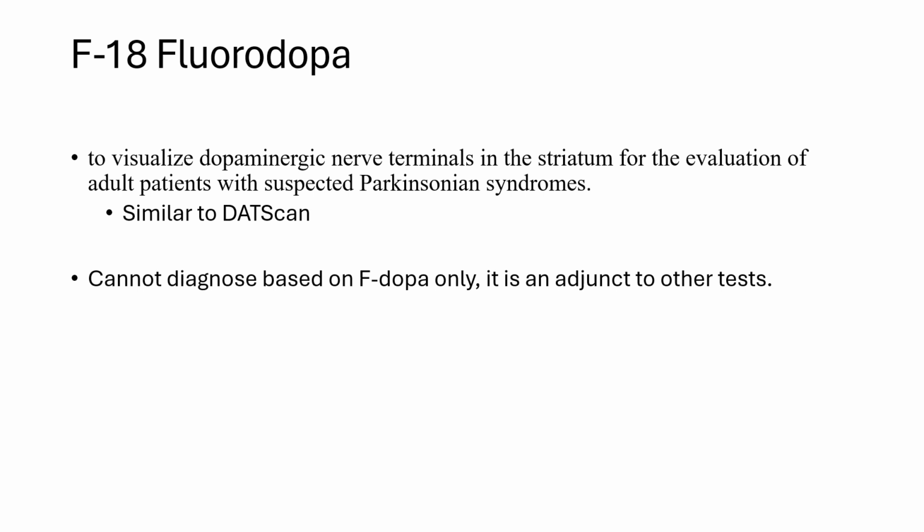We cannot diagnose based on F-DOPA only, so it's very similar to DAT scan in that as well. Both of them are used as an adjunct to other tests, and diagnosis cannot be made based on the nuclear medicine scan alone.